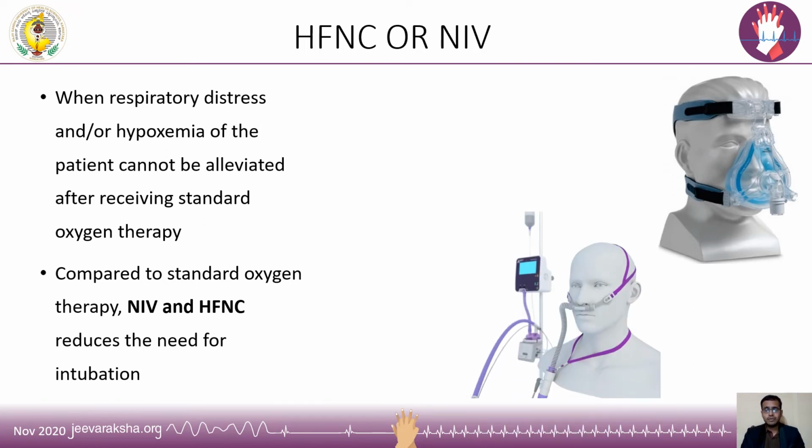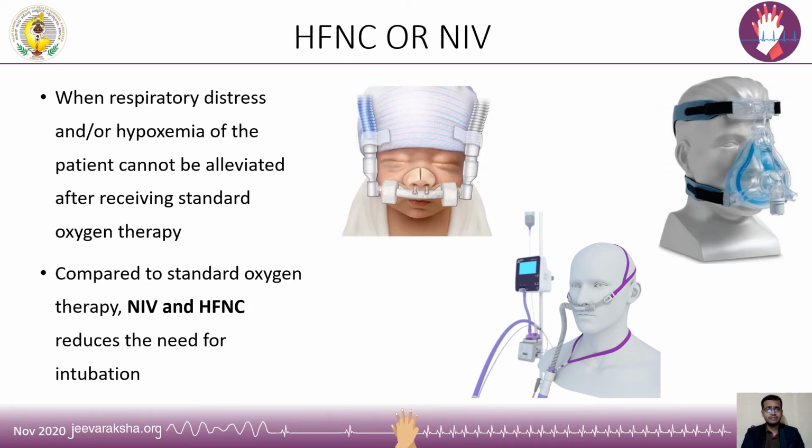The other form would be your high flow nasal cannula, which is used only for oxygenation. So both these devices can be used for a non-invasive purpose. If the patient worsens, you can go ahead with mechanical ventilation.